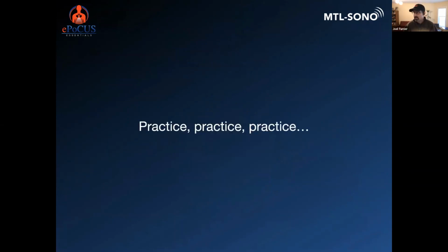And even though some patients come in and you don't think that there is any issue of right ventricular problems, practice on every single patient that you're going to assess the LV, go over to the RV and just practice, even on your healthy patients, to practice recognizing what you're looking for so that it becomes second nature, so that when you assess your patients who are very sick, it becomes easier for you to do actual measurements.